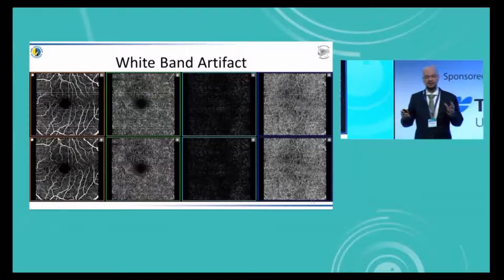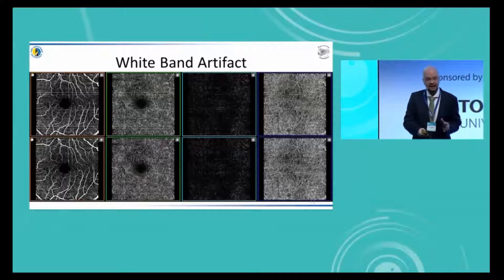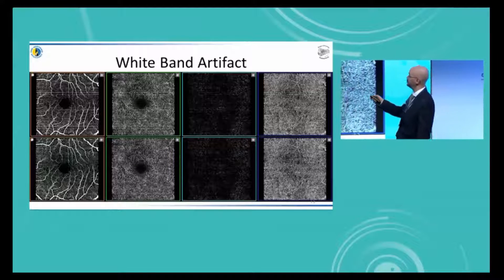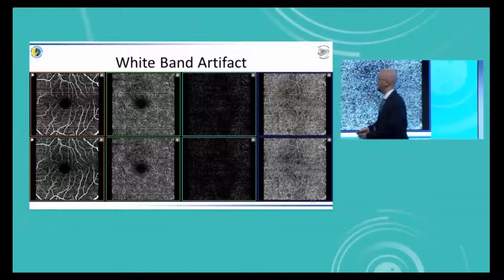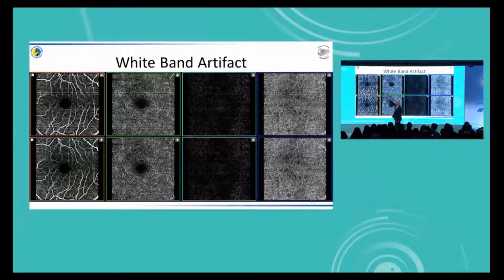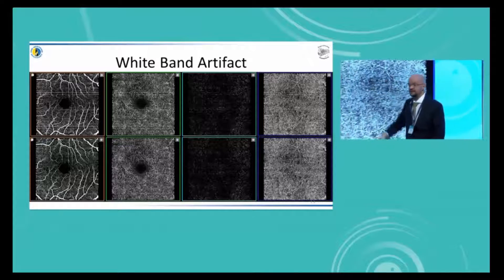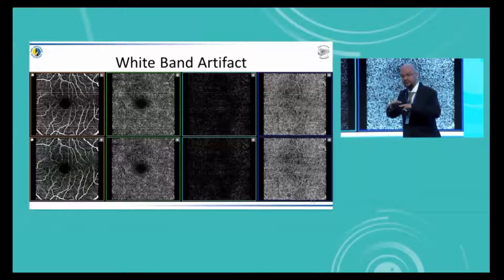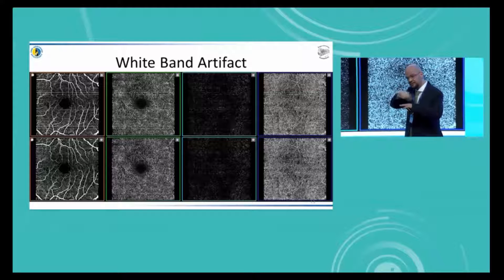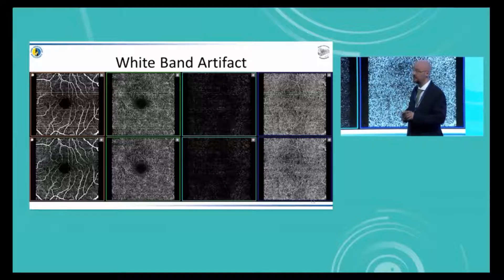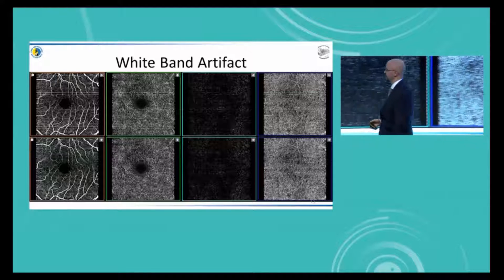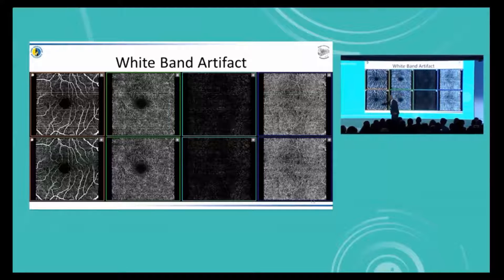Another type of artifact seen in OCT angiographies is the so-called white band artifact. You can see these little white bands going across the entire scan, following through all the different layers all the way down to the choriocapillaris. This is due to movement during the actual algorithm — between scans, the patient moved. Luckily, this is now very easily removed using software in post-processing, immediately eliminating these white band artifacts.